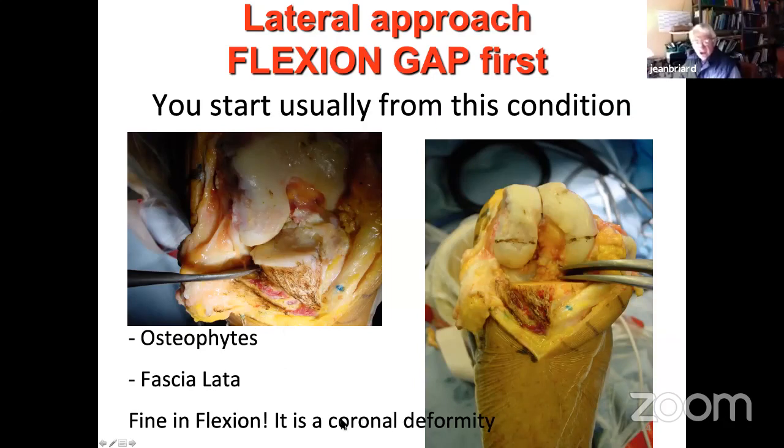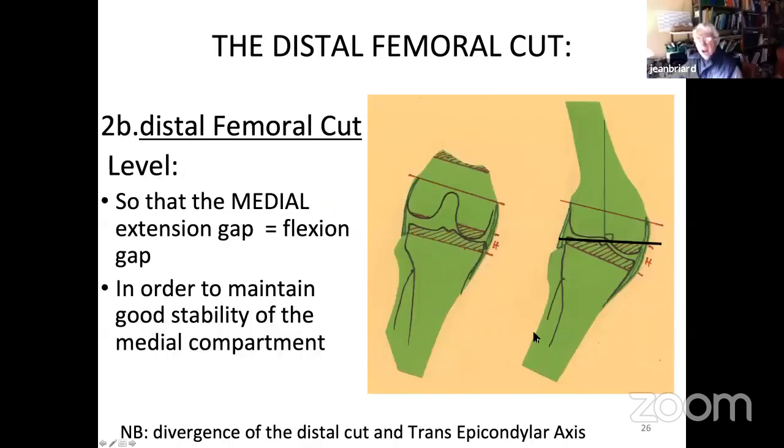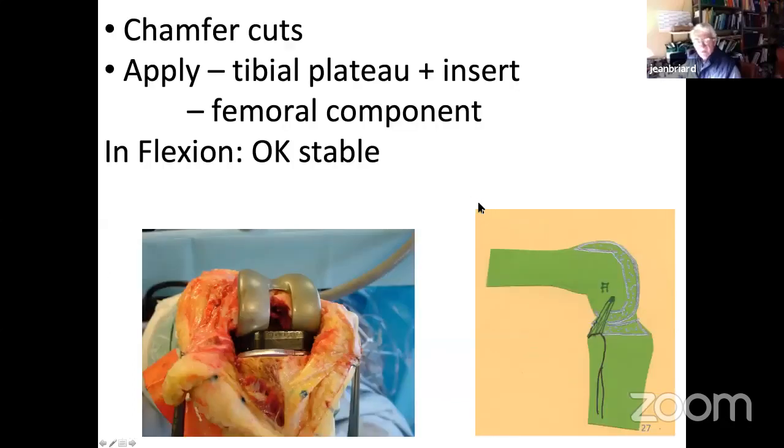You are fine in flexion. Remember, it's only a coronal deformity. So in flexion, you don't need any release because you have the good primary mechanics. You can perform AP cuts. And then in extension, you have to correct the coronal deformity, so your medial extension gap should be equal to your flexion gap. And you see here, no problem. We made no release at all at this time.